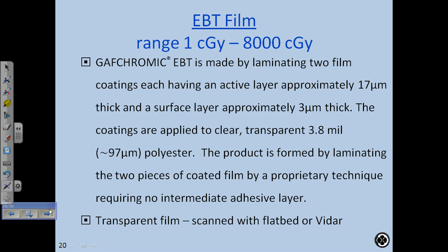Range 1 to 8,000 centigray. EBT is made by laminating 2 film coatings, each having an active layer approximately 17 microns thick and a surface layer of 3 microns. Okay, transparent. This is the polyester. This is the same thickness as before for the polyester base. Okay. The product is formed by laminating the 2 pieces of coated film by a proprietary technique requiring no intermediate adhesive layer, and it's transparent.